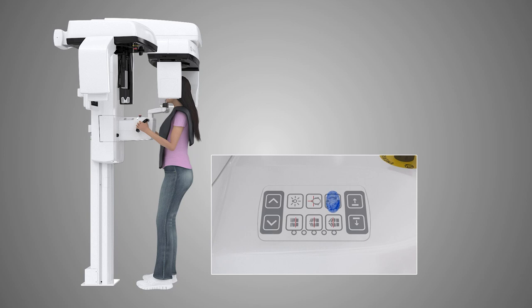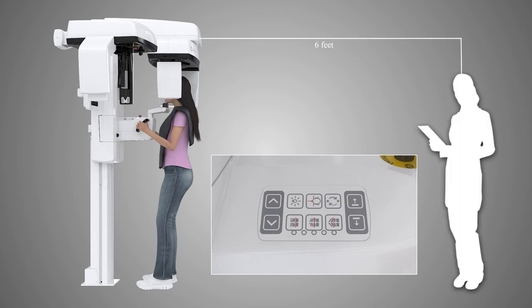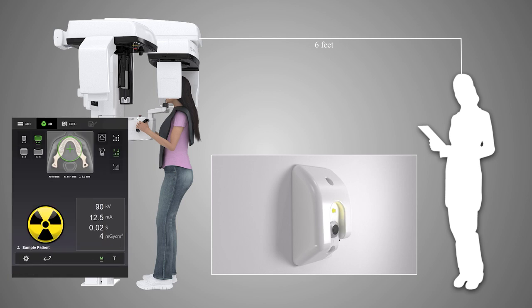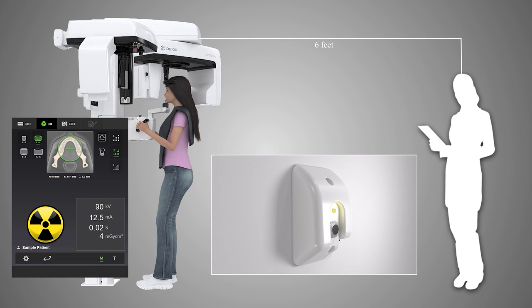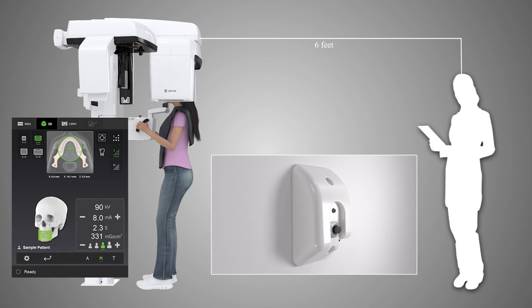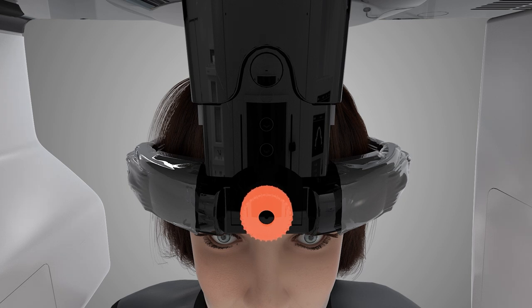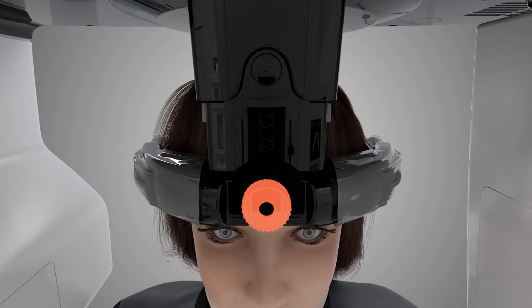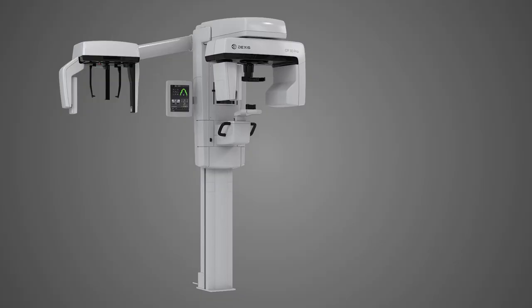Press the start button on the positioning panel. Move a safe distance away of at least six feet or behind a suitable x-ray shield while maintaining line of sight to the patient during exposure. Press and hold down the exposure button. The rotating unit rotates around the patient's head. An audible signal and the exposure warning symbol on the touch screen will appear. Once the image has been acquired, the rotating unit and the audible signal stop. Release the exposure button. Release the temple support using the adjustment knob and carefully guide the patient out of the unit. Remove all disposable covers and disinfect the unit following the directions in the user manual.